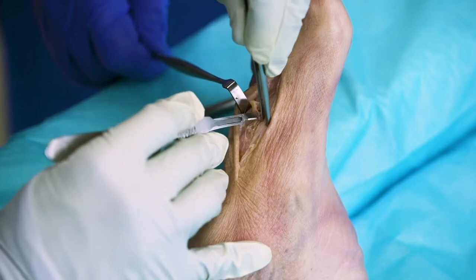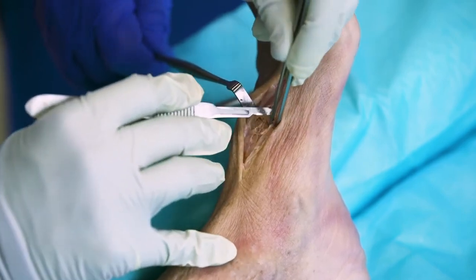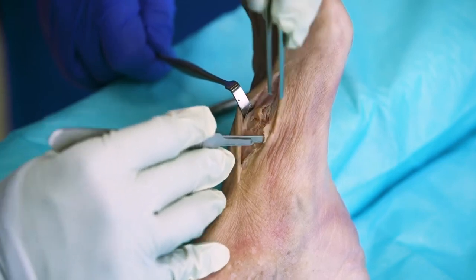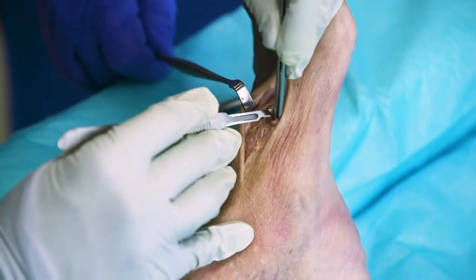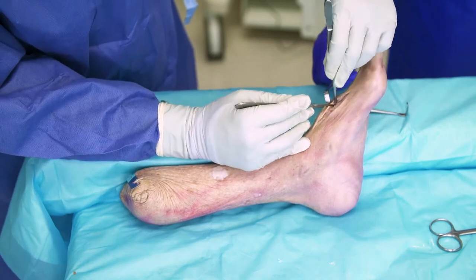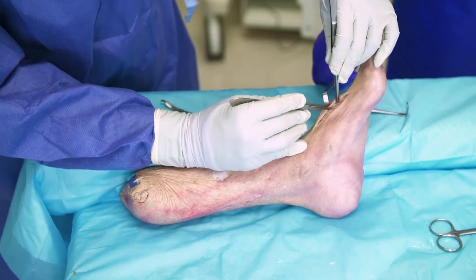The stout ligaments of this joint are plantar, so taking down the dorsal capsule should not destabilize the joint if you're checking for instability with Lisfranc injuries. For Lisfranc injuries, I prefer dorsal plating of the first tarsometatarsal joint as opposed to transarticular screws. Both have very similar biomechanical strengths, but I prefer the dorsal plating to try to preserve the joint and avoid several screws going across it. Putting transarticular screws can potentially lead to degenerative changes of the joint, so I prefer a dorsal plate.